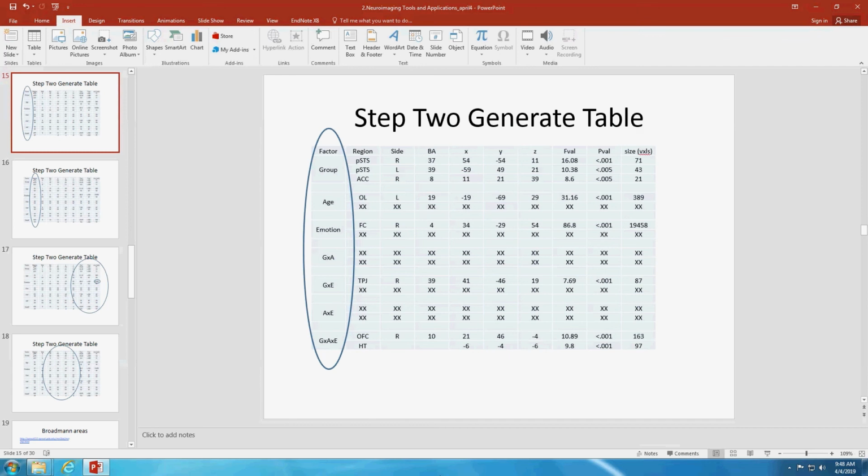Yeah, there is just inherent variability from person to person in some areas of activation. Language tends to be in this area, where Broca's area tends to be, but you can't say precisely where it is. Then you also lose some of that when you put everybody into this sort of normal space, when you're stretching and pulling and crunching. So whenever you get your activation, it's kind of, this is the neighborhood where you're seeing it. You can't be overly rigorous on saying this is exactly what we see in all subjects.